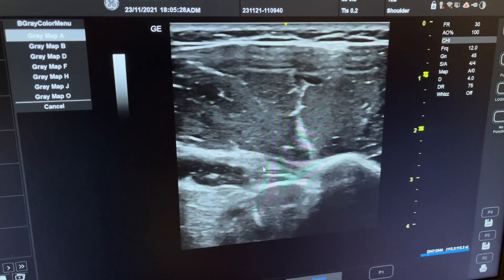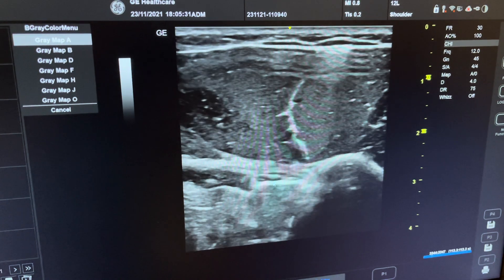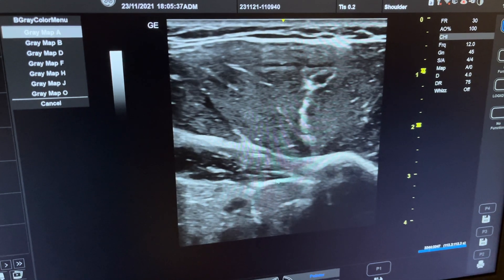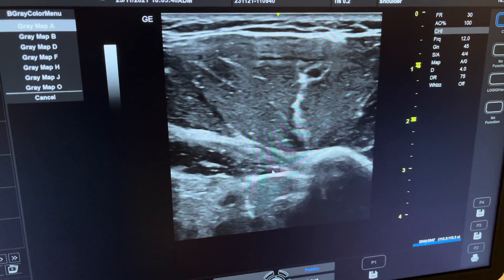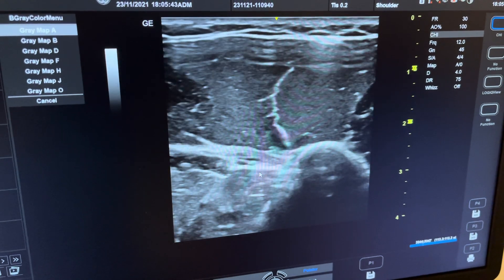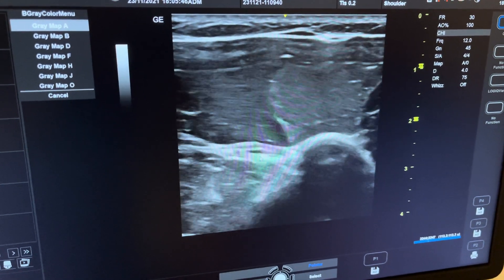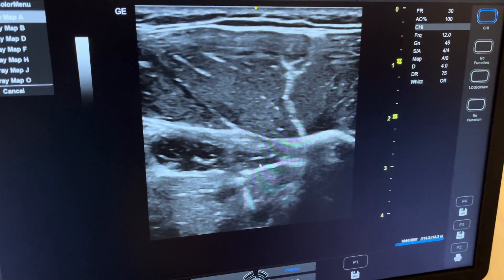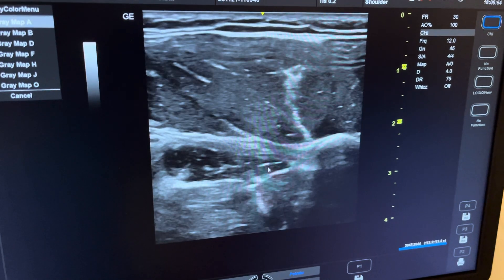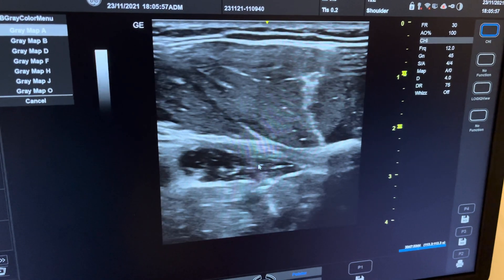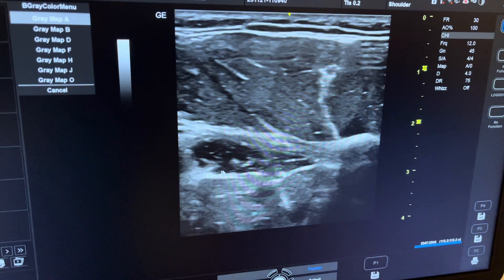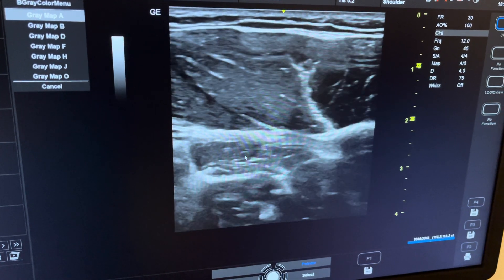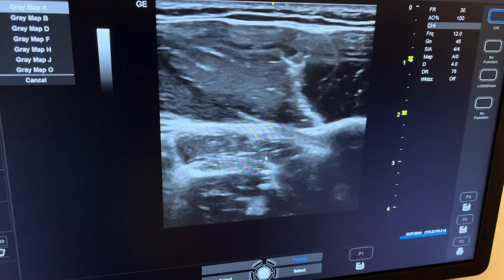You can see that bony prominence right there — this is the pectoralis major. Here is the tendon of the biceps, and going a little more distal, the tendon becomes muscle belly. This is the muscle belly of the long head of the biceps. Going back proximal, the belly disappears and I only have the tendon; going down again, the muscle belly starts to form — so this is the myotendinous junction of the long head of the biceps. Looking medially, we see another, slightly bigger muscle belly — the short head of the biceps.